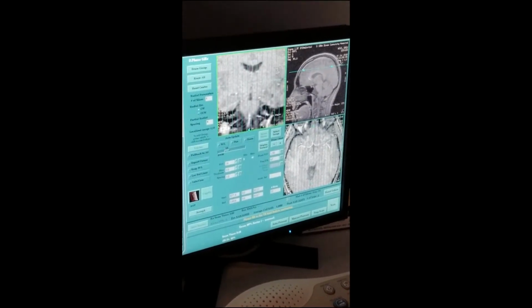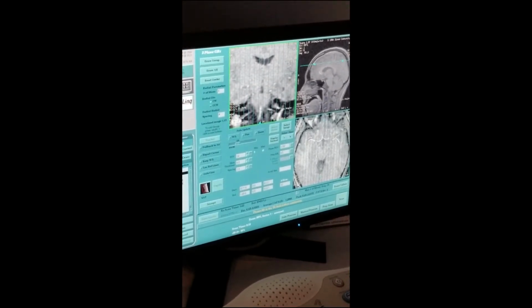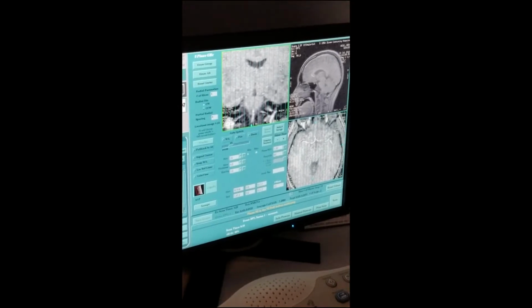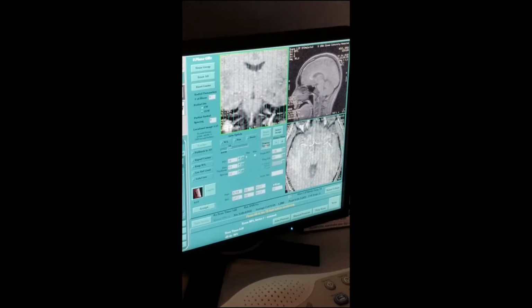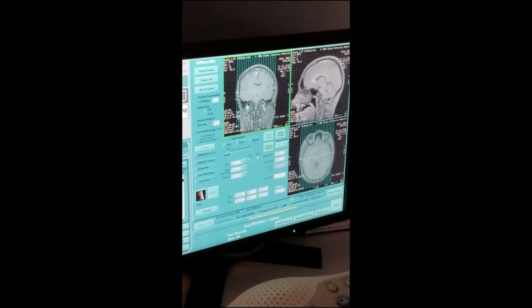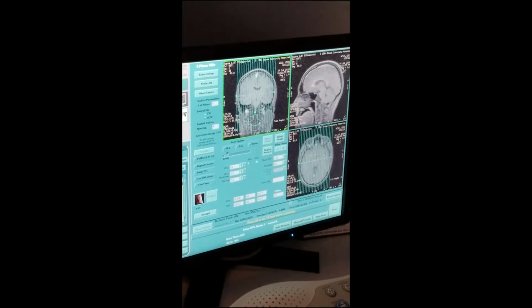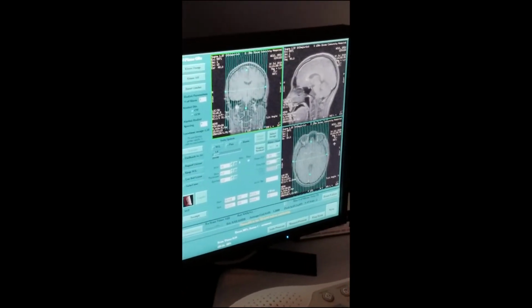and say, see here, can you see? Yes, I can, and you can say, oh, this is the ventricle, so how about if I go a little bit like that? I'm just saying, okay? And then you say, okay, rather than play with this, just click display normal. And say, you know what, maybe I angle it over a little, maybe a notch. These are just playing around. Okay, so then this looks good.